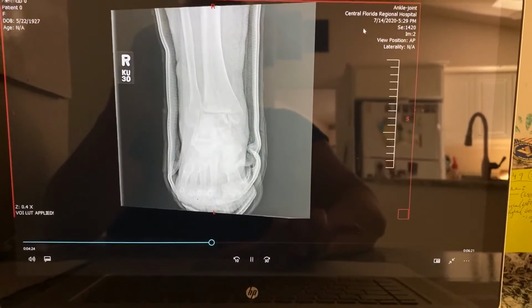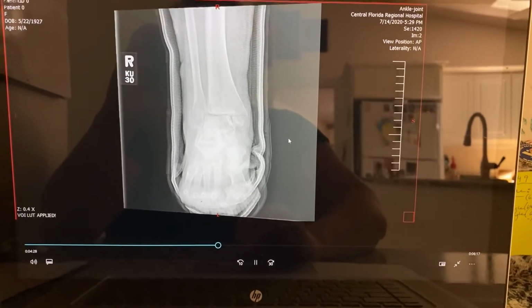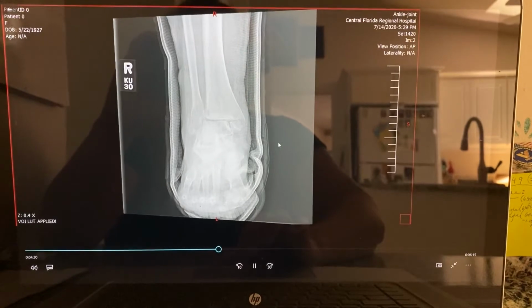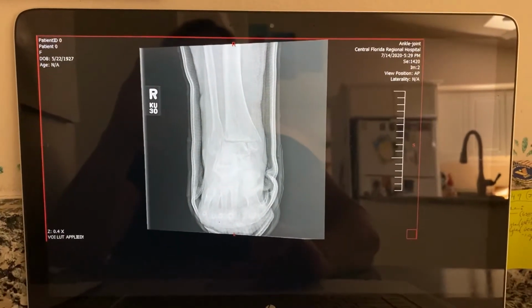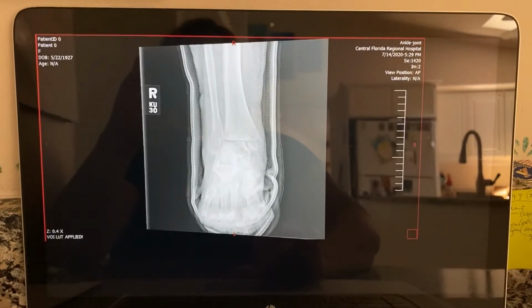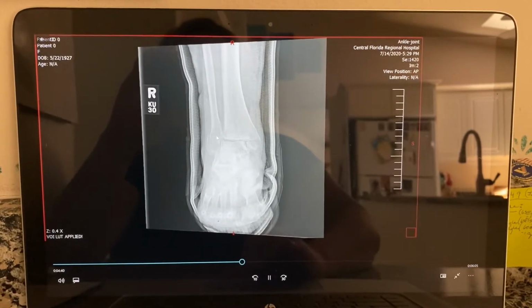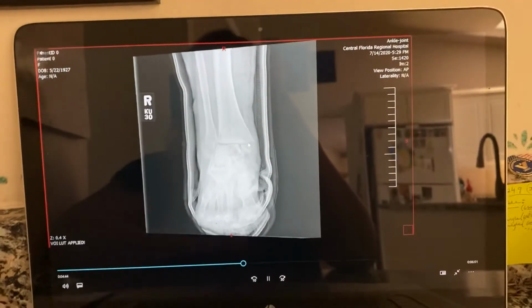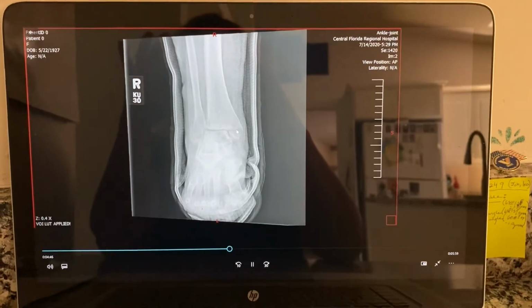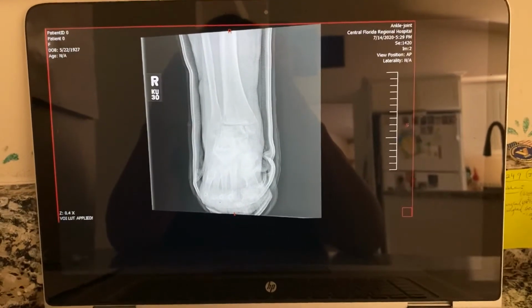The part, tube, and IR were all aligned. This is her medial oblique AP mortise, supine on stretcher with the tabletop IR. To obtain this position, the central ray was directed 30 degrees from lateral to medial and midway between her malleoli through the cast to compensate for the patient's condition.